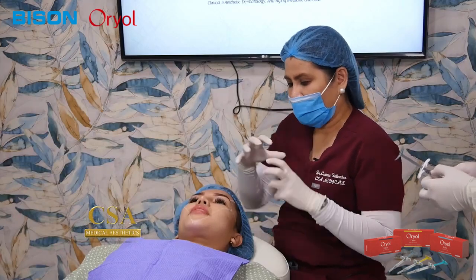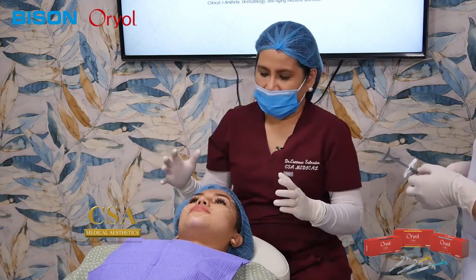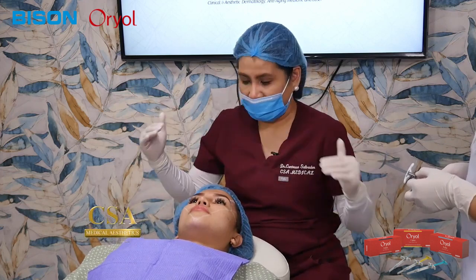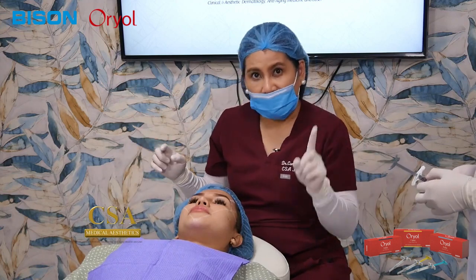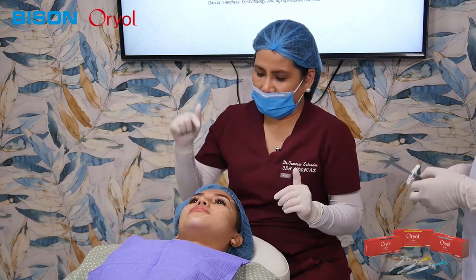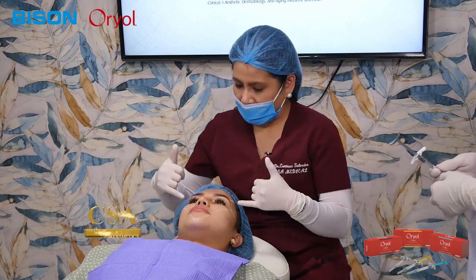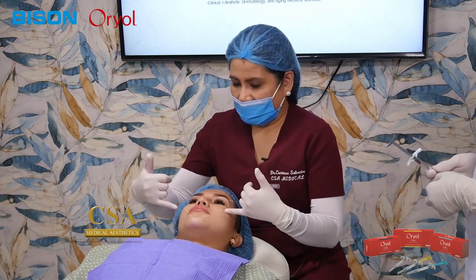Okay, now, product. So we'll be using hyaluronic dermal filler. For this kind of volume restoration, we'll be using the so-called high G prime filler, something to give also projection, lifting, and restoring volume, because fillers have different rheological properties. There are several kinds of fillers, so your injector should know what specific filler to use in a specific anatomical region. And then in terms of the technique, I'll be using a needle, a bolus injection only onto the supraperiosteal layer only.